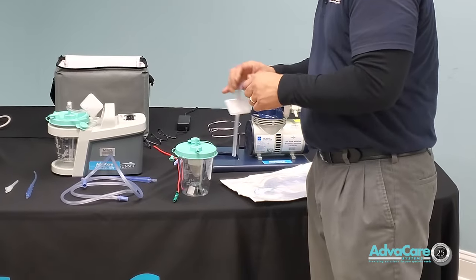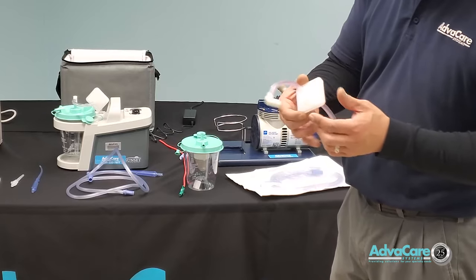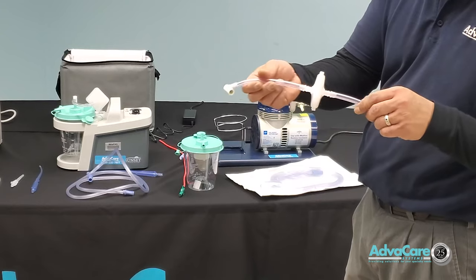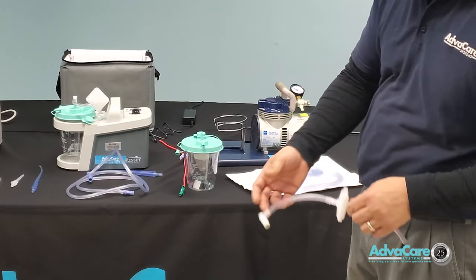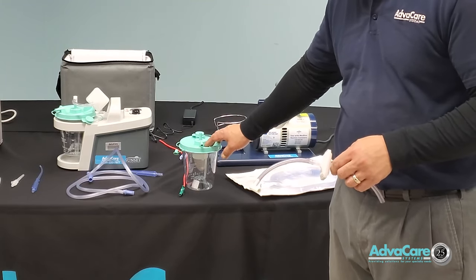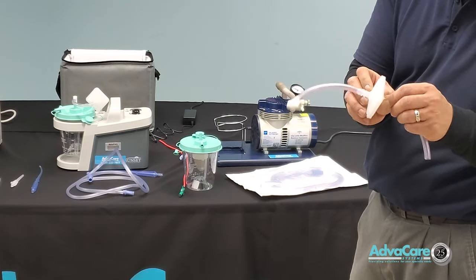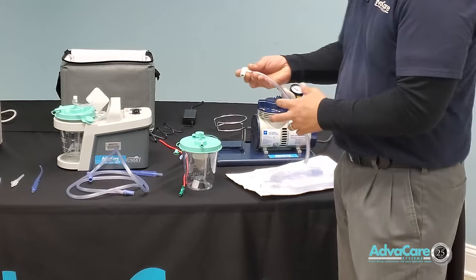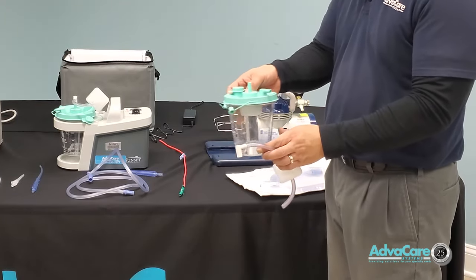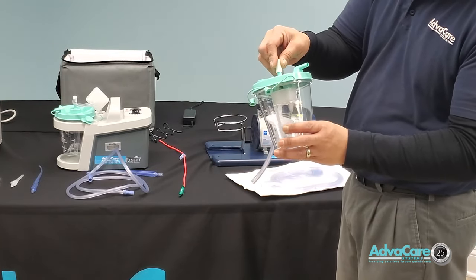There are two secondary measures. The float on the inner side of the canister cap is the first protection for the machine. Then you have a suction filter which is hydrophobic — secondary protection to prevent fluid from entering the machine if the canister were to become overfull. This hydrophobic filter protector has an elbow, usually connected directly to the center point of the canister cap, just above the float.